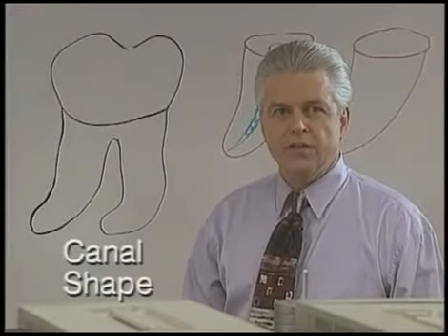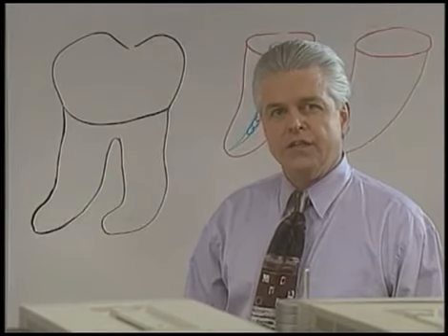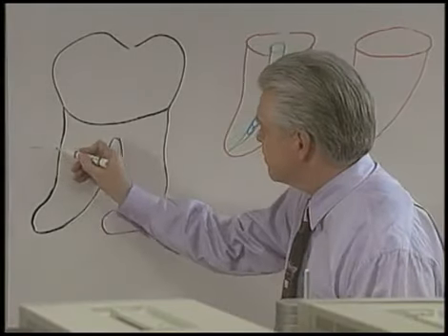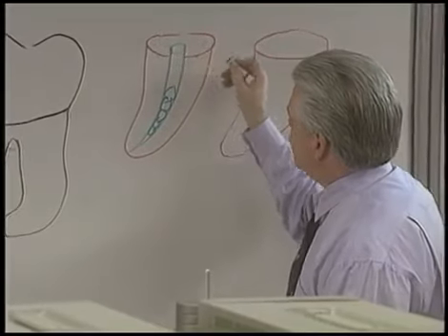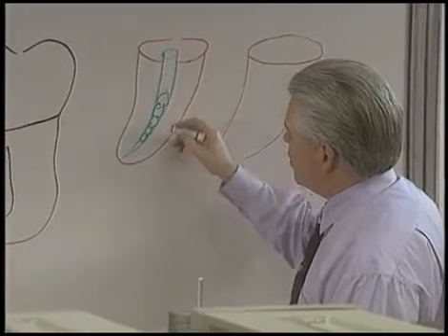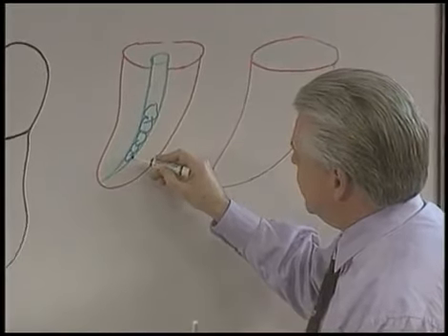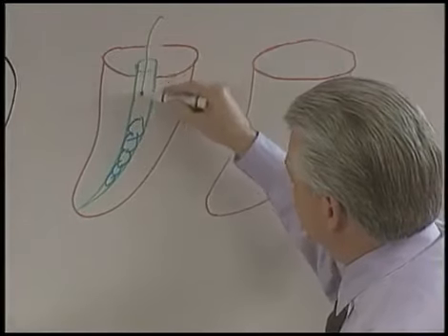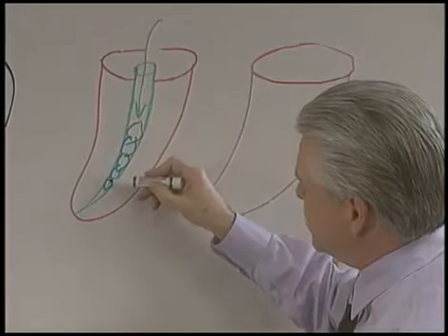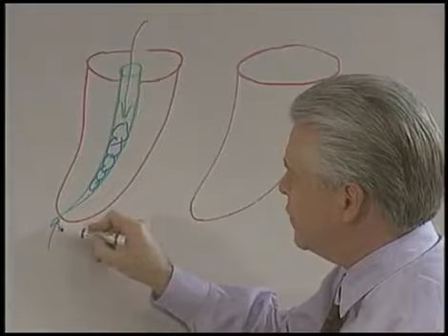One of the advantages of understanding root canal system anatomy is to appreciate that not all canals are round. Let's look at a cross-section of this root. This particular root is frequently quite round, and the canals that are harbored inside the roots are relatively round. So when an instrument gets broken in this canal, the root's relatively round, the instrument is theoretically round, and it makes it difficult to negotiate and try to bypass the fragment, even though with effort and chelators sometimes we can reach the terminus.